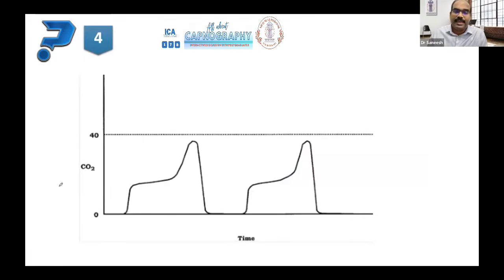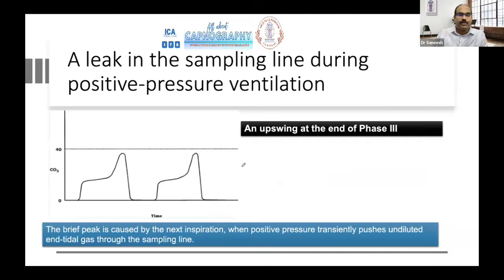Yes, this is again a similar one. Yeah, Dr. Manas or Dr. Aditya. Yeah, sorry. So it's a sampling line leak. Okay, again, it's another manifestation of the sampling line leak, which we can easily recognize and do something about, right?